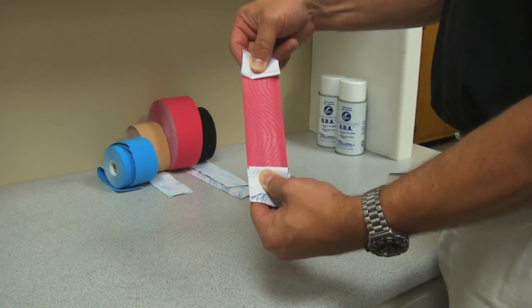You can use what's called just eye strips, which are just a basic cut of the tape, where you can cut different patterns in the fabric to just make it look cool and neat for the athletes and kids. I actually tape a lot of pediatric patients. I've taped kids as young as 5 weeks old, and I tape a lot of kids now that are having problems because they walk on their toes, so facilitate them to get a heel strike while walking. We tape athletes with just common strains and sprains, surgical patients with excessive swelling, older patients with back injuries or neck injuries. Again, you're limited to the imagination of the therapist, just knowing how the general anatomy of the body works to what you can come up with and tape.